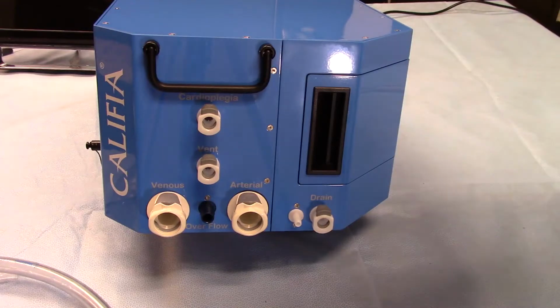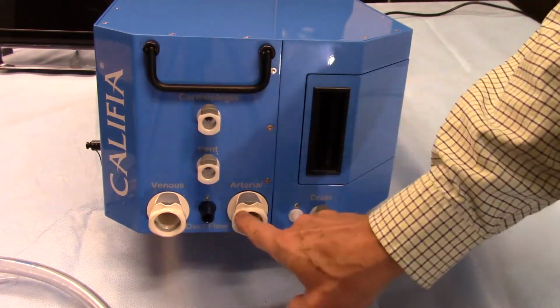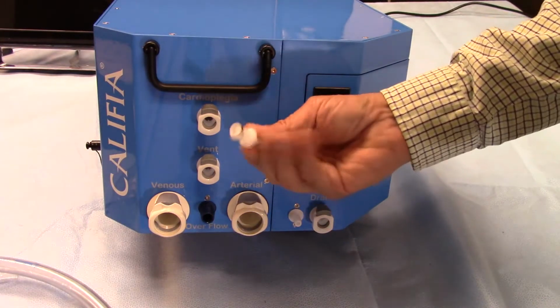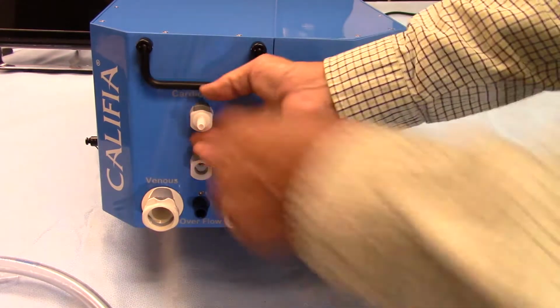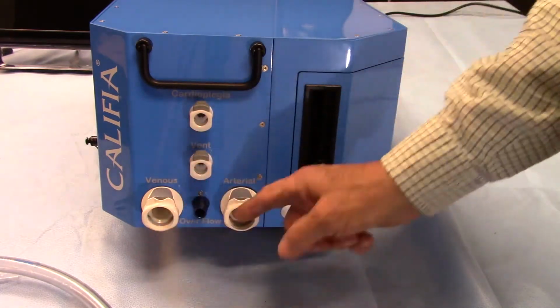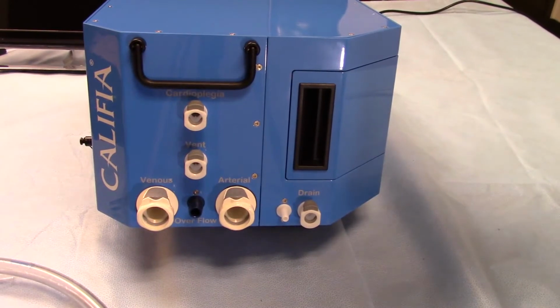This picture of the back end of Califia shows the various connections. These large quick disconnects are labeled venous and arterial. These smaller ones above, cardioplegia and vent. Now you saw the connections that go in these, simply pushing in like that. One thing to notice about these, or to make note of, is the fact that these are not valved. These will definitely leak if there's any water behind them.